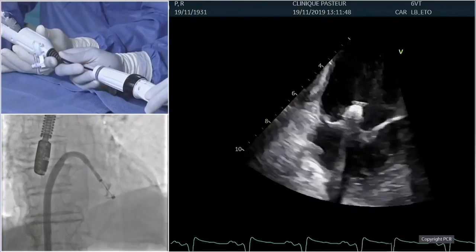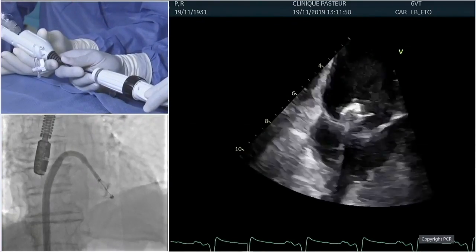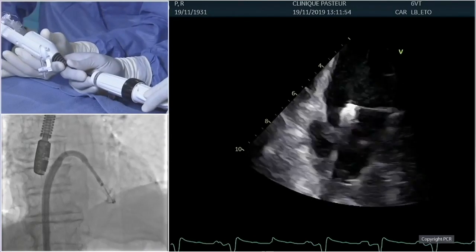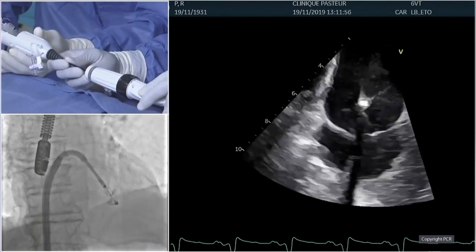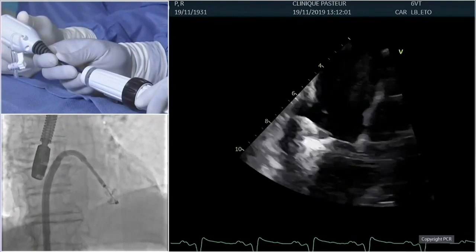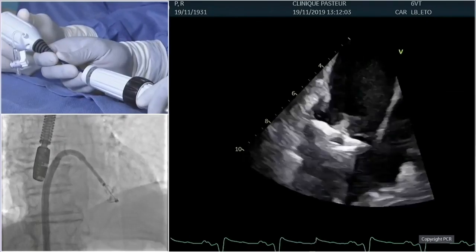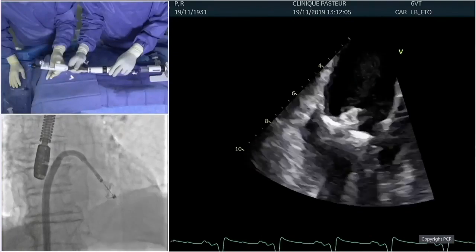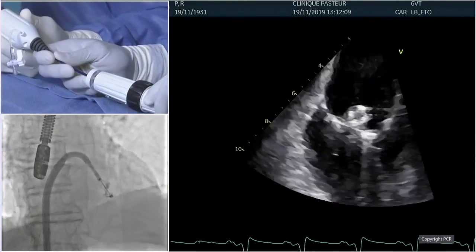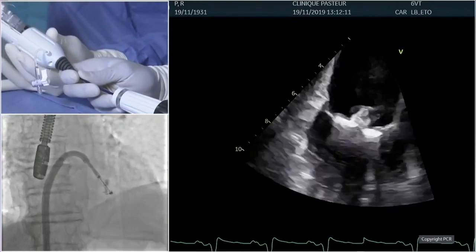We were too posterior, we'll go a little bit more anterior. Okay, dive a little bit to be sure that we see the leaflets resting on the pedals. Let's just optimize the picture. Okay, Laurent. Nice, nice like that. It's visible. Okay, I guess it's okay. Let's optimize a little bit the anterior. Both are on top, I guess.